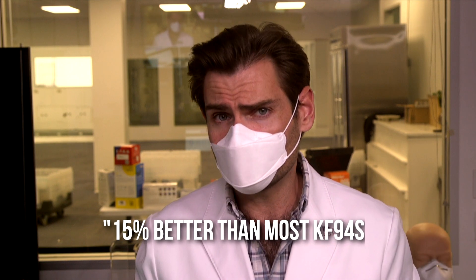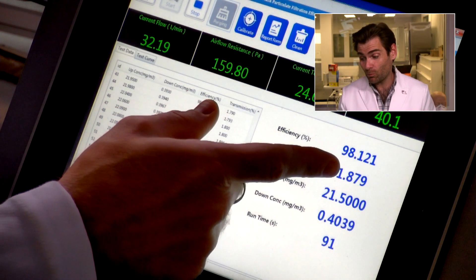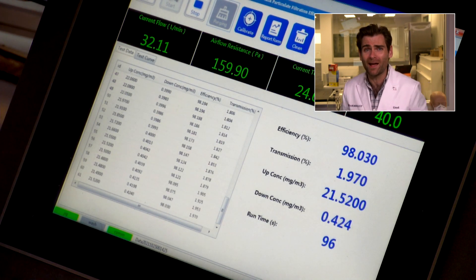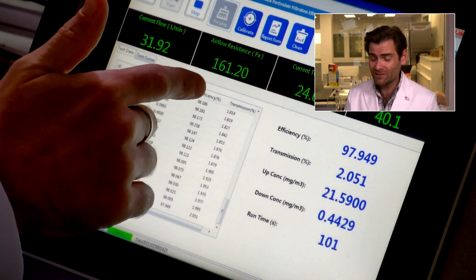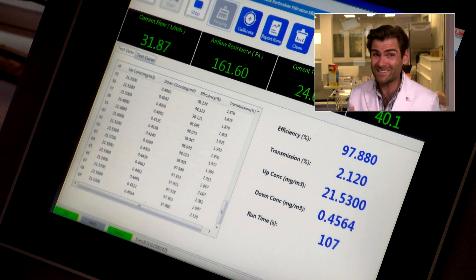Seems to fit my face pretty good. I would call this smell 15% better than most KF94s. Not terrible. 98.121 and airflow of 160 Pascals. I've seen more breathable masks. Typically the ceiling for me is 150 Pascals, so it's a little high, but I'm not going to ding them too hard on that. It is a kid's mask, so I'd like it to be even more breathable, closer to 100 Pascals.